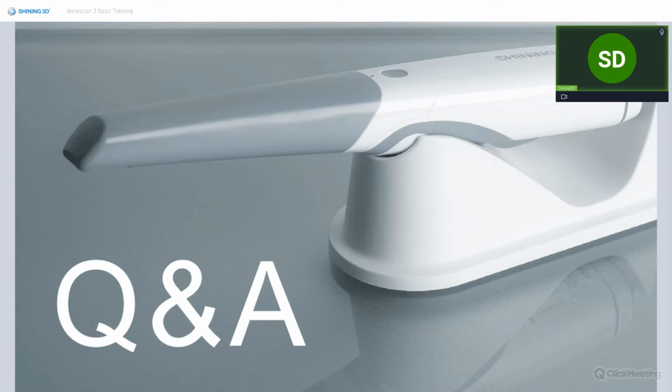This is the difficult point when we try to align different data. So if you are trying to scan for complete dentures or full denture cases, you need to find a way to fix the gingiva. For example, in China, the doctors use something like a hook to fix the gingiva. This is the way to scan for full dentures.